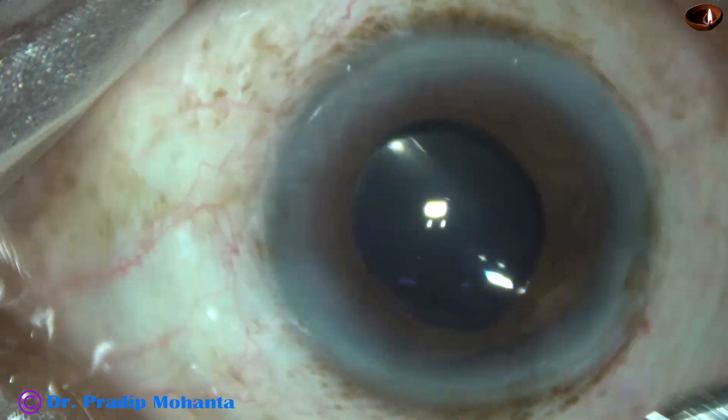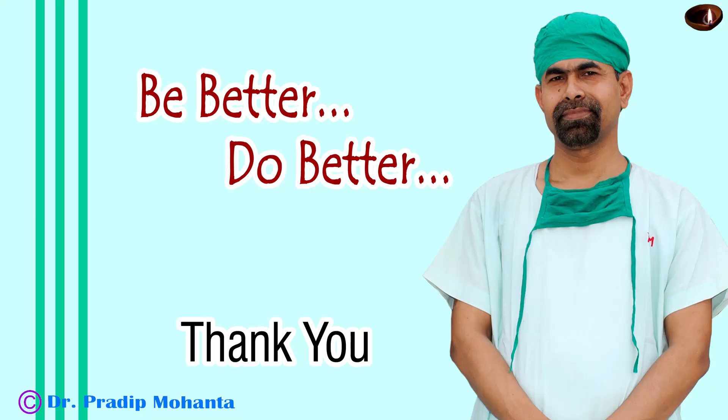The case is concluded. Thank you very much for your attention. Hope this video will help you in developing your surgical skills — particularly in trying to divide the nucleus into pieces by a pre-chopper. This pre-chopper is from Dr. Sohail Irfan Khan from Nanded, Maharashtra. Thank you once again for your attention.